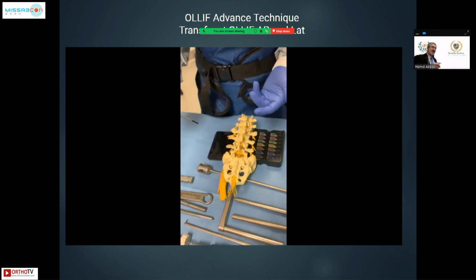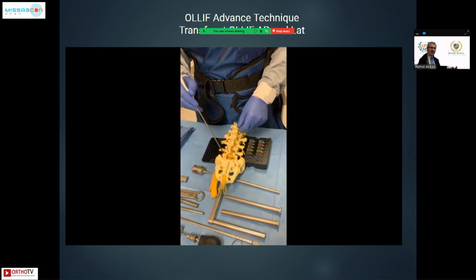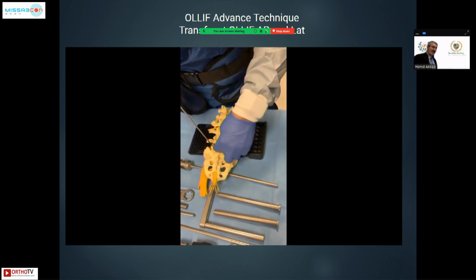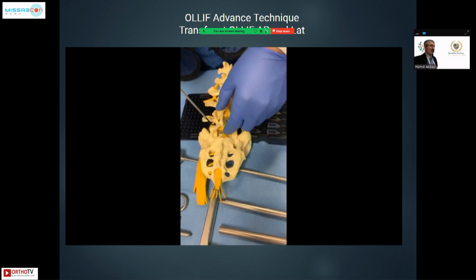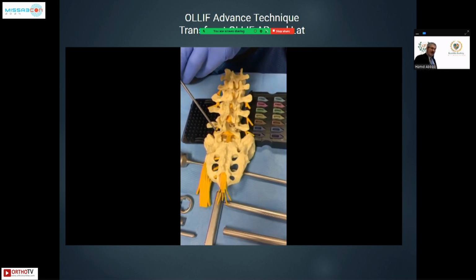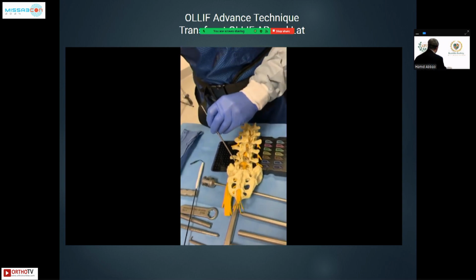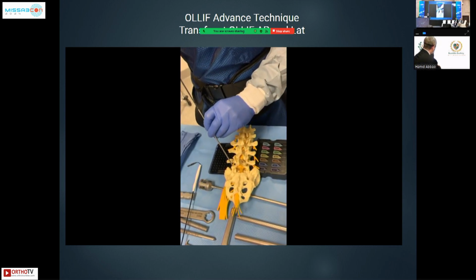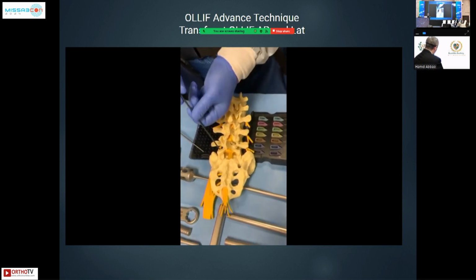In that case, you will be in the retroperitoneal space. In that case, it is what Dr. Kambin described: an extraforaminal approach through Kambin's triangle, which, by the way, is not foraminal. Your entire surgery will be outside of the foramen, so it is not really a TLIF by definition. But in this case, in a 2-step drill, we identified the trajectory. You will see the x-rays. I have enough time to show you the entire video.